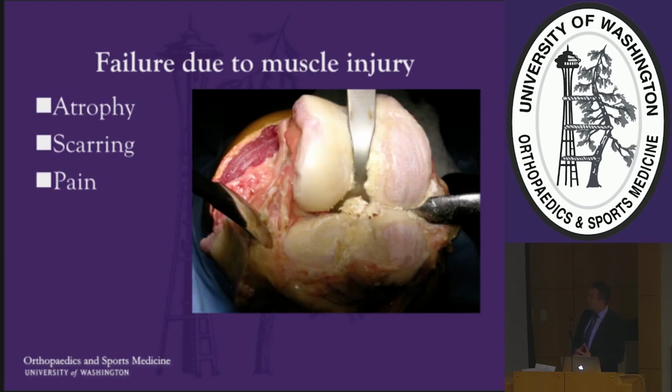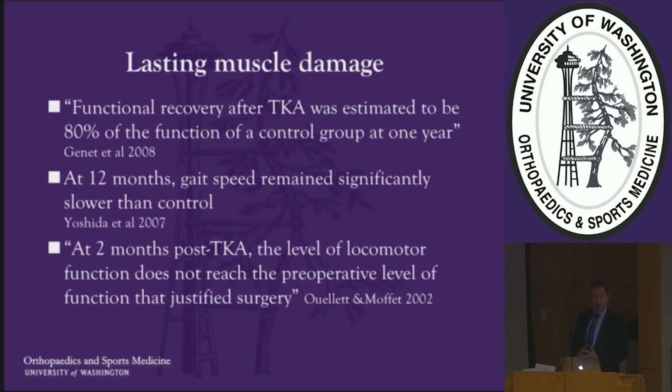So it's clearly easier to put implants in straight with an exposure like this. The problem is that there's a trade-off between good exposure and lasting injury to the muscle sleeve around the knee. Traditional exposures cause lasting muscle injury with substantial short and long-term sequelae.